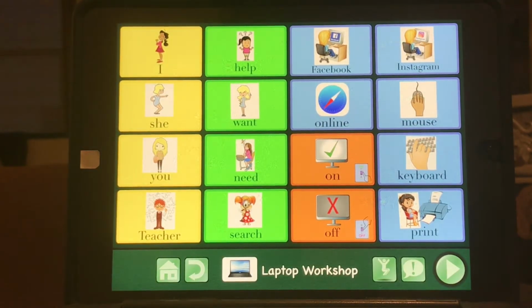In an effort to expand the client's ability utilizing the GoTalk Now program, 3 communication displays have been tailored to meet activities favored by the client. These are computers, dancing, and music. The client has been observed to understand the function of common objects. She has also been working on her vocabulary acquisition of verbs through identification of actions in pictures. This element remains a target for therapy and has been incorporated in each activity's display.